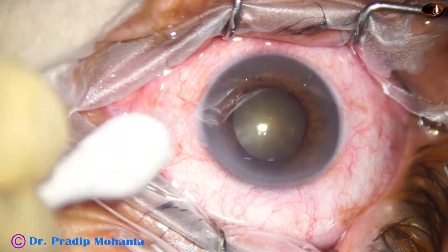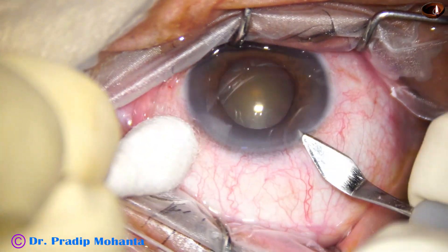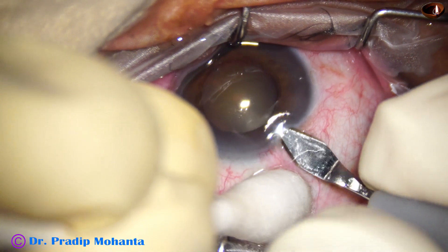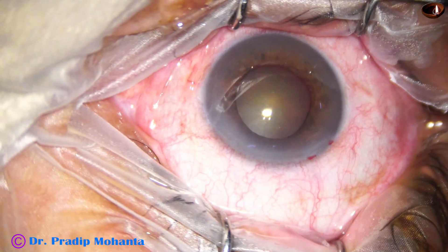This is a cataract with grade 2 nuclear sclerosis. The anterior chamber is shallow and the pupil has not dilated well. The size of the pupil at this time is about 3.5 millimeters.